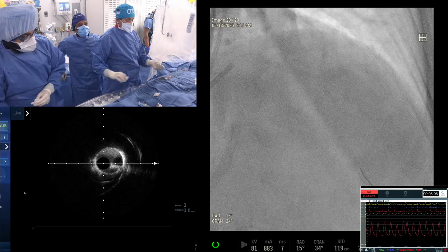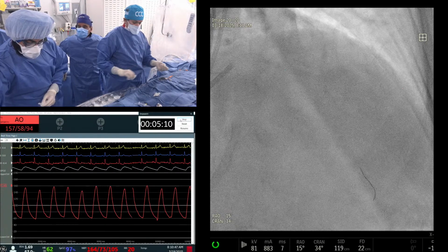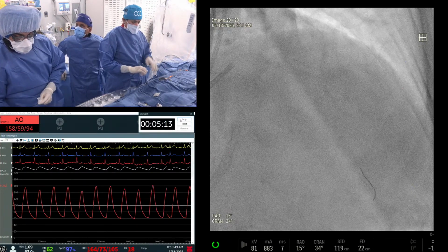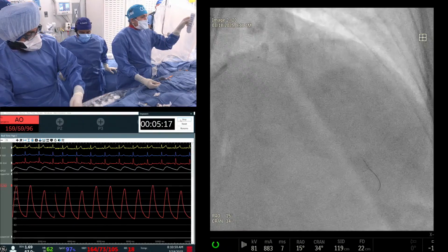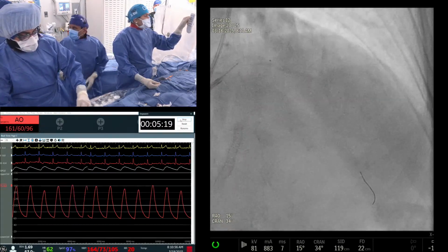But anyway, it just showed that there is a question now based on that. Anu, do you want to say the left main is significant or not significant because your IVUS did not go? No, I don't think we can make a decision on that.